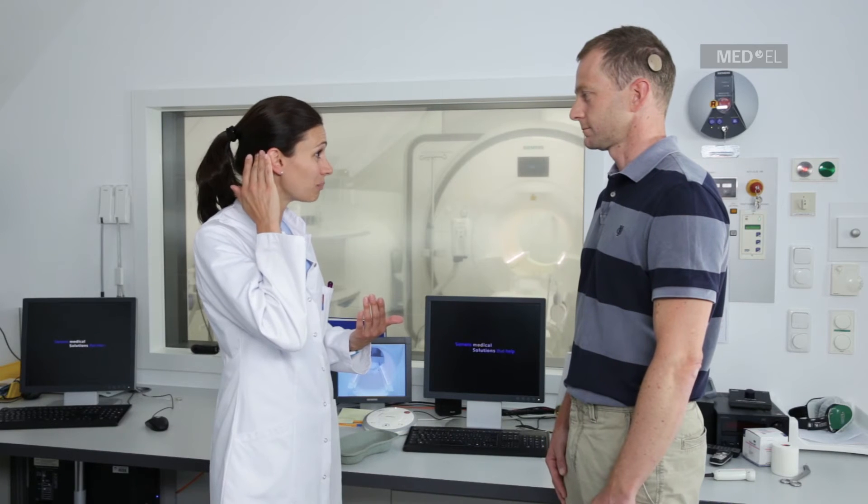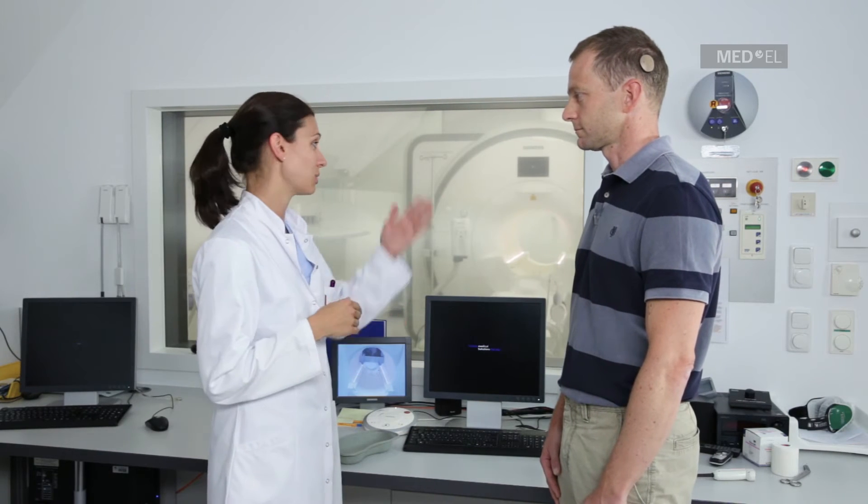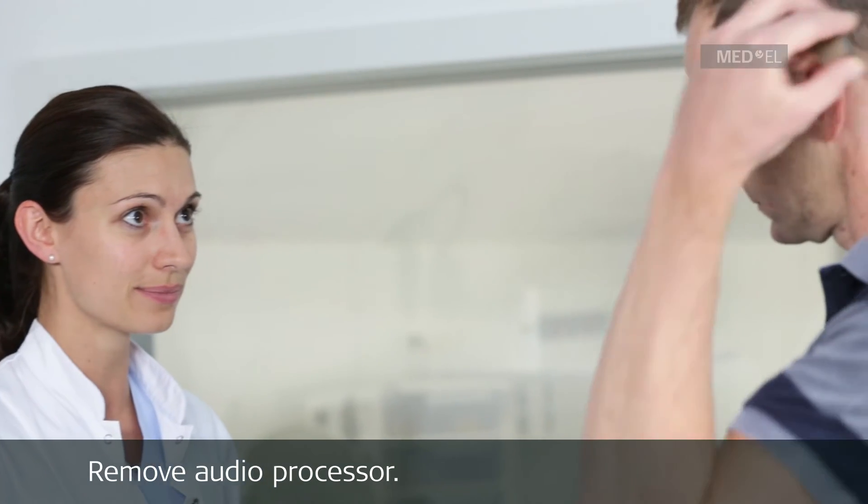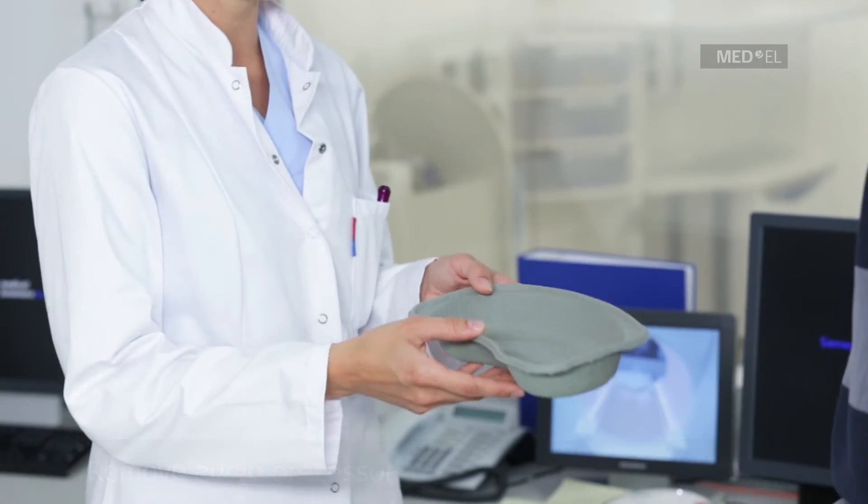Remove the external components of the implant system, such as the audio processor and any accessories, before the patient enters the scanner room. The patient may not be able to hear after removing the audio processor, but will be able to hear immediately after the processor is returned to its correct position on their head.